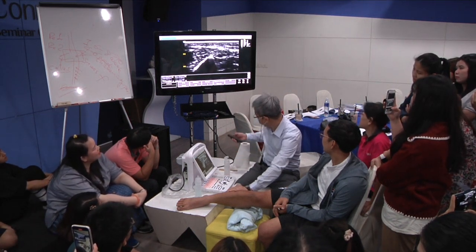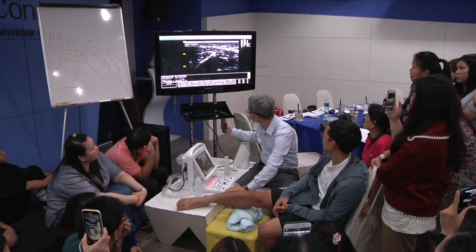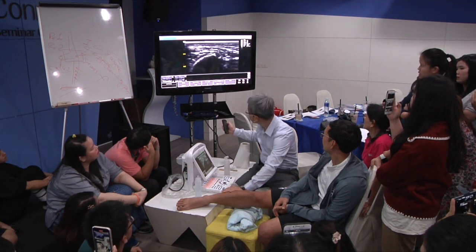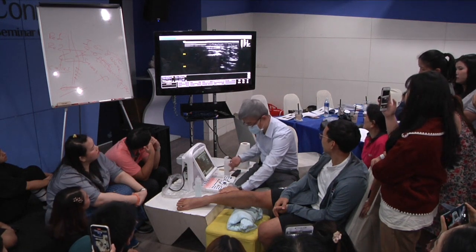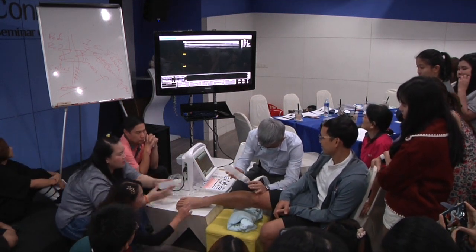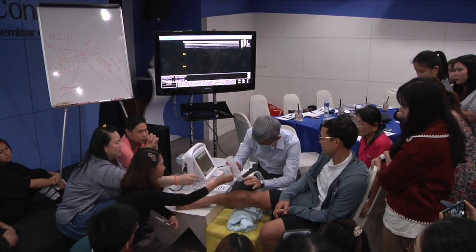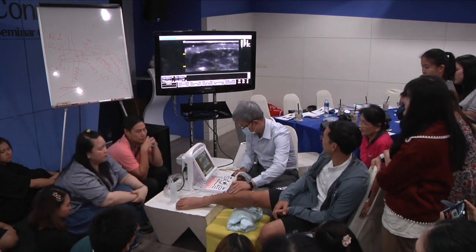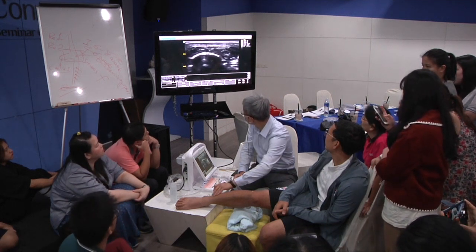Go with the tendon. To here. Yeah. Right, see the tendon, right? Tendon in the middle.